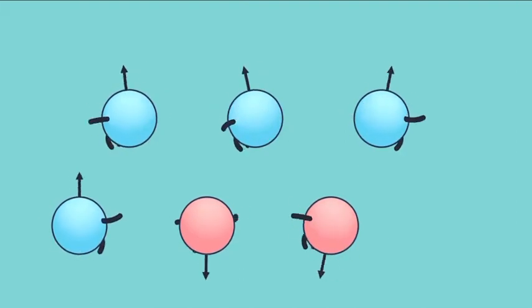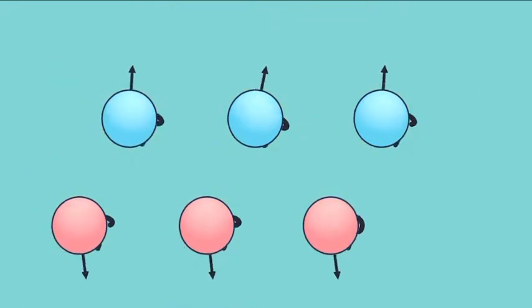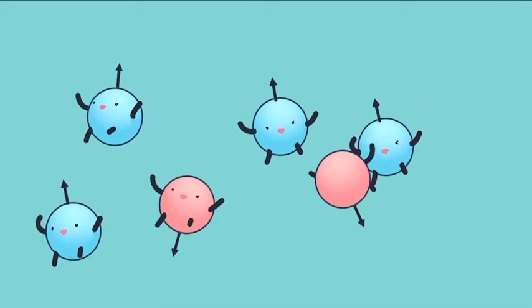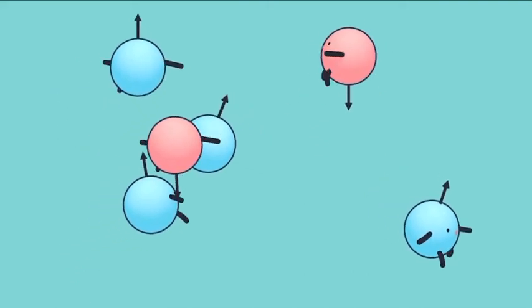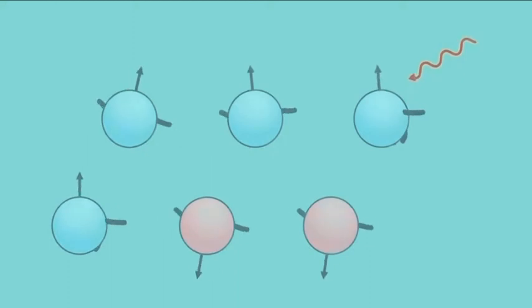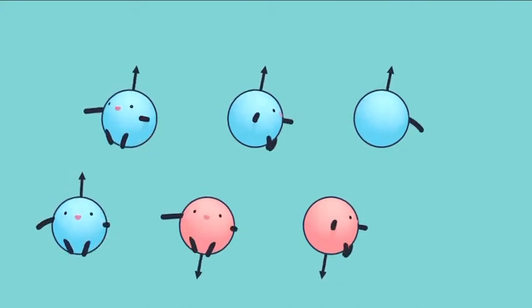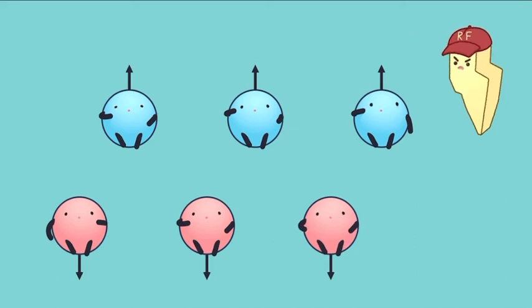To recap, we've put some energy into the system and temporarily convinced each of these protons to sit down and get it together. This doesn't last long, much as if you were knocked off of your feet or if I yelled at my wild little children as they ran haphazardly around their playroom. Recovery is imminent. They'll behave for a short time, but they'll soon return my energy back to me as the baseline state of disorder is restored. Much like my children, the protons will recover, or return to their original state of orientation with the magnetic field and asynchronous precession.